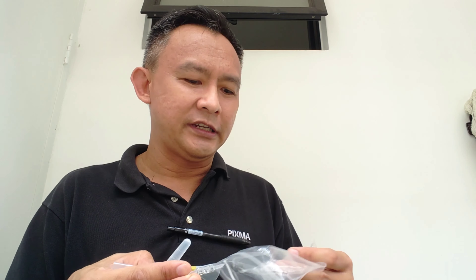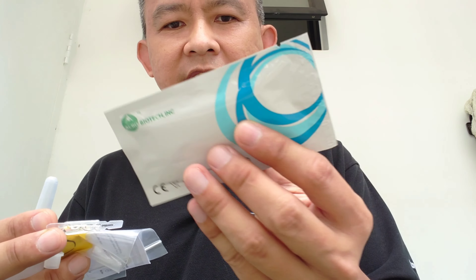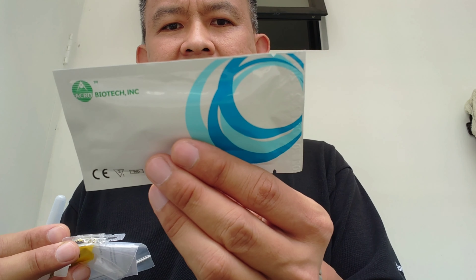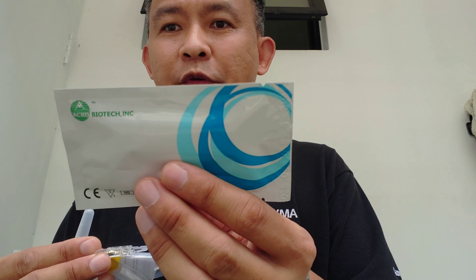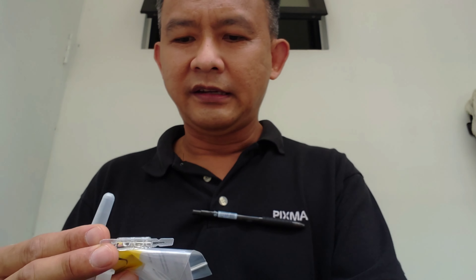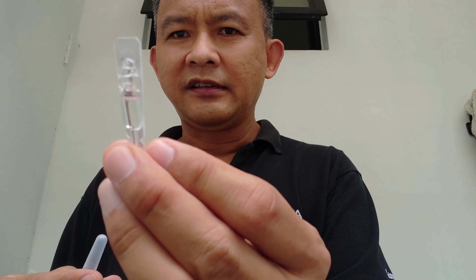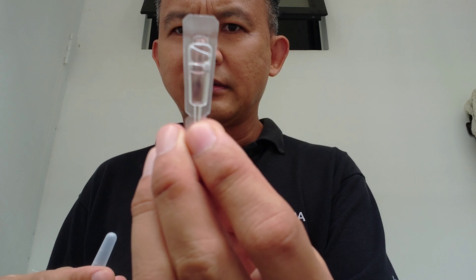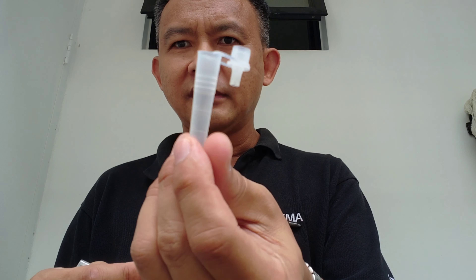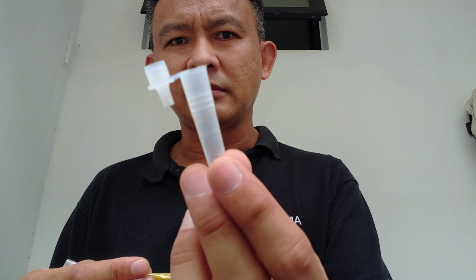Let's follow the instruction manual. So inside here they have this Biotech antigen rapid test oral fluid, right there. And they also give this kind of liquid.